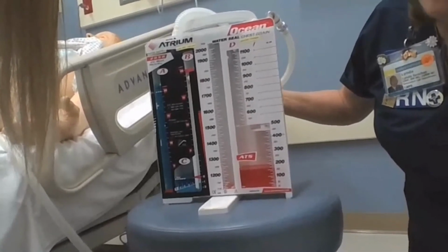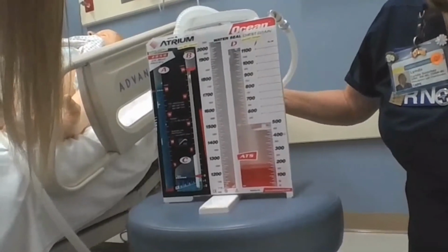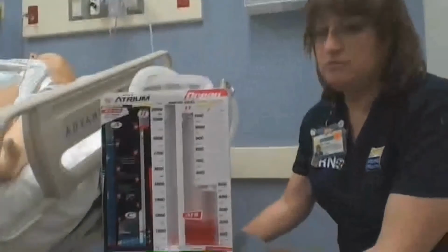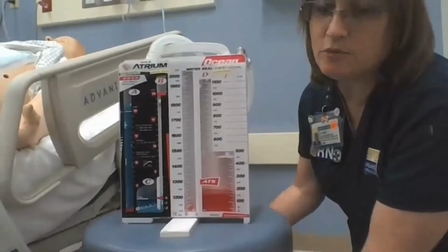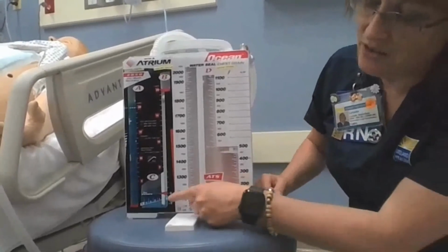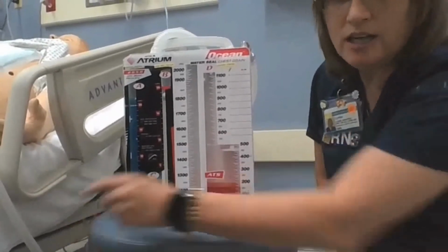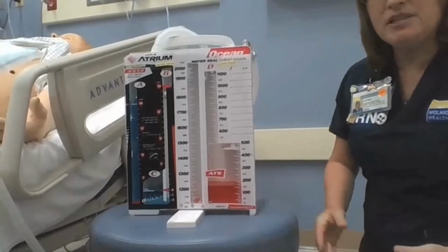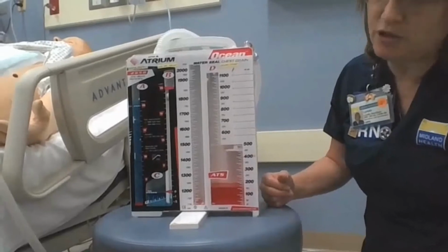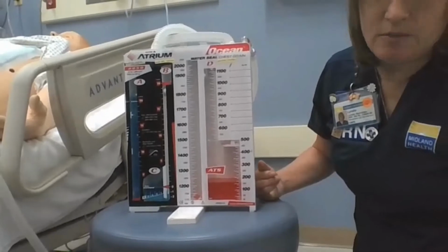There are a couple of reasons why that ball might not move. The first one and most obvious is your patient isn't breathing. If this little ball not moving was the first thing that indicated to you that your patient wasn't breathing, then we have a few issues. You missed something on your assessment. The other reason that ball might not move is that there is a clot, a kink, or your clamp is on, and so the little ball can't measure the change in intrathoracic pressure. Or the third reason could be that the chest is healed and the chest tube is ready to be removed.